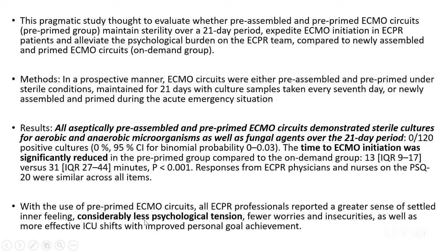and it has considerably decreased the psychological stress on the treating team. So three important take-home points from here is that the ECMO circuit can be primed and kept. So if you're doing ECMO once in 21 days also, in that scenario also, you can keep one circuit primed and you can use it. So this is one thing which seems a little interesting.